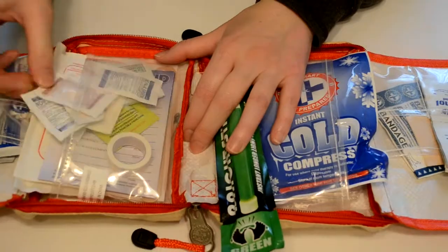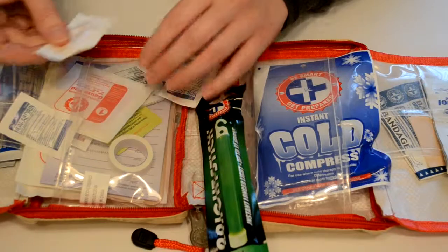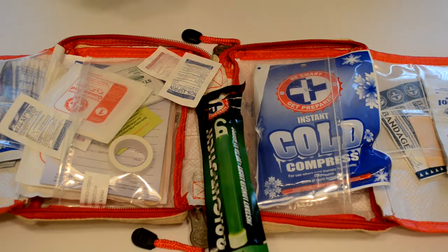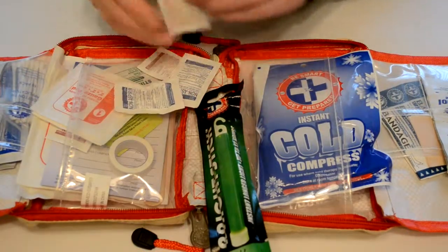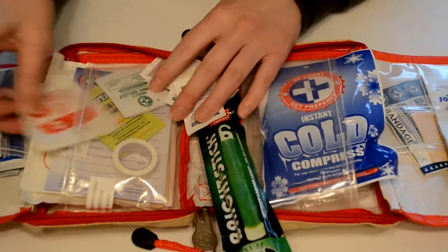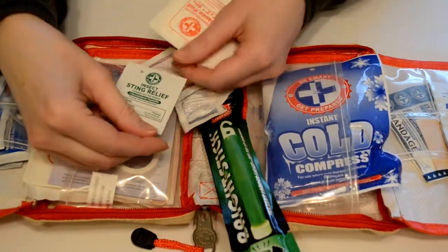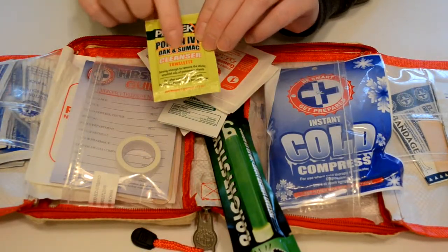We've got some aspirin and some non-aspirin, as well as some metalite. I'm not sure what metalite is — it might remind me of something like Gatorade if you're starving. And so we've got some gauze pads, we've got some insect sting relief pads.